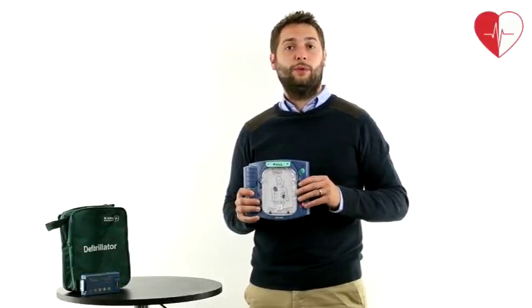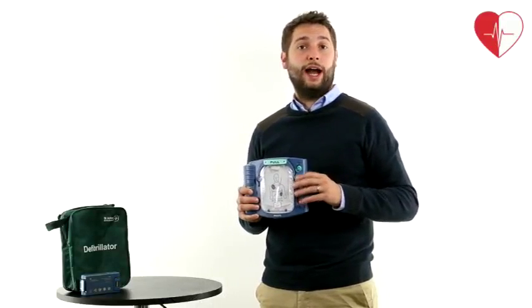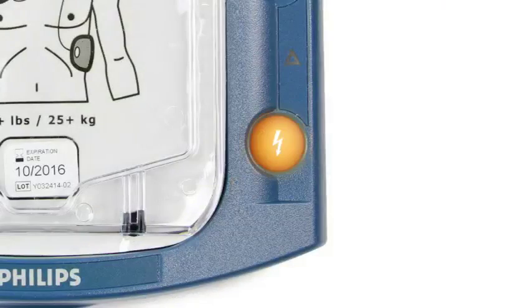This defib unit will determine if a shock is needed, and if one is required, the orange button at the front of the unit will begin to flash and voice guides will instruct you when to press it.